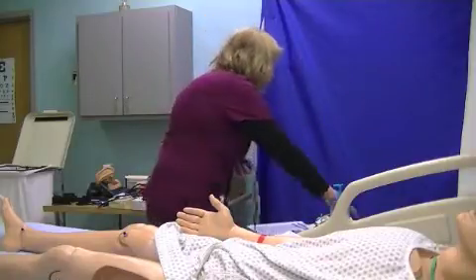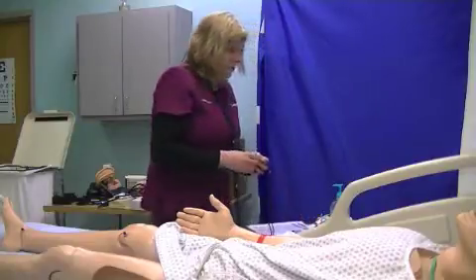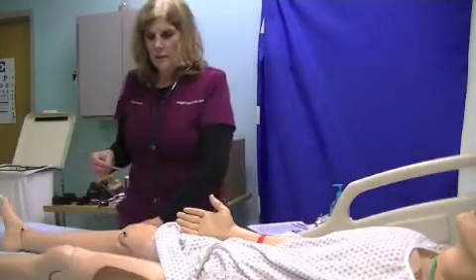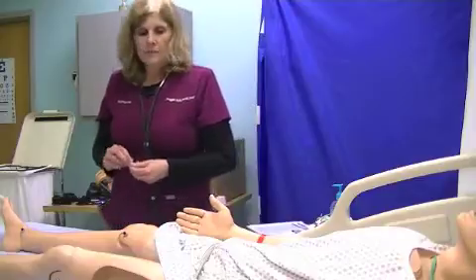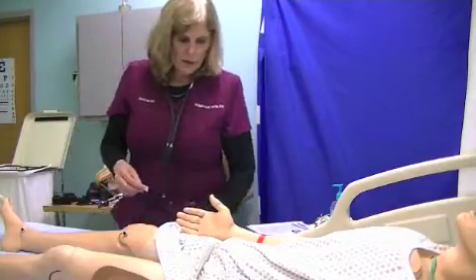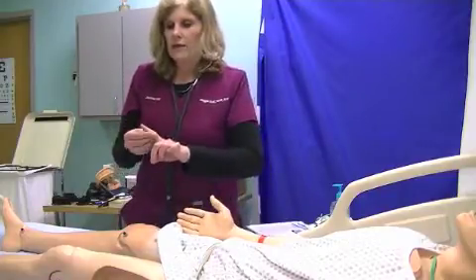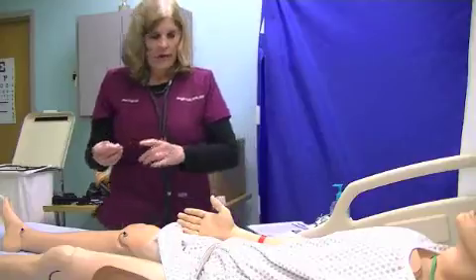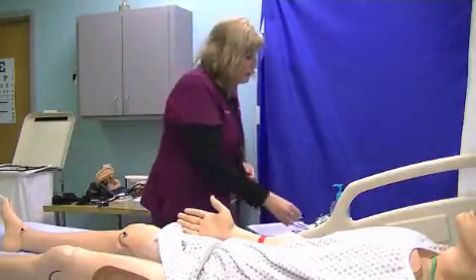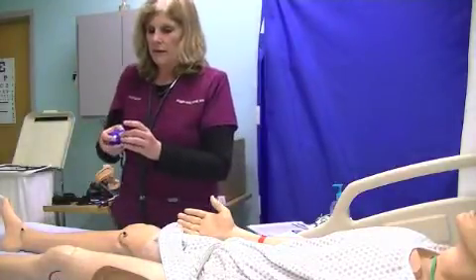Now this little device here is called a pulse oximeter. Now the main things that you're going to remember for the pulse oximeter, you need to assess. So if they're having respiratory difficulty, you're going to make sure you clean the finger. Or I'll clean my finger in this case so you can see what I'm doing here. Make sure it dries, because that again prevents the spread of infection. You don't want to use a pulse oximeter and then go use it on somebody else.